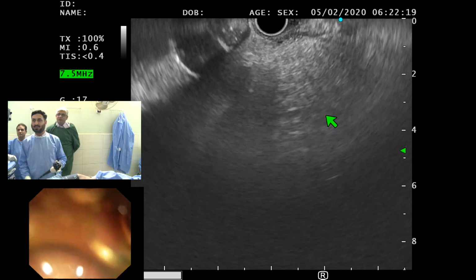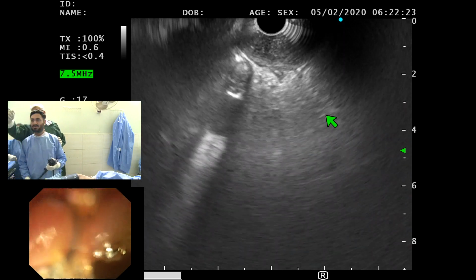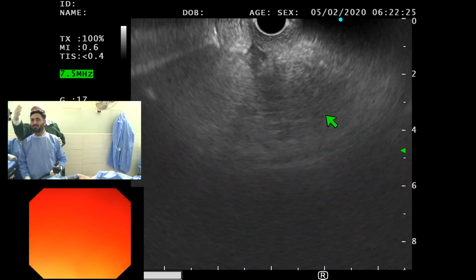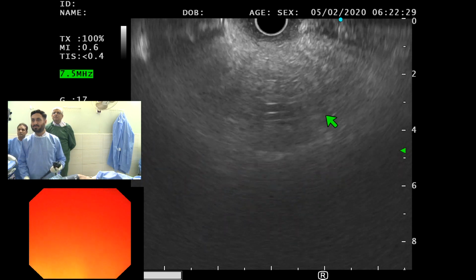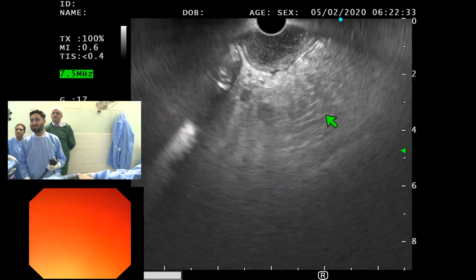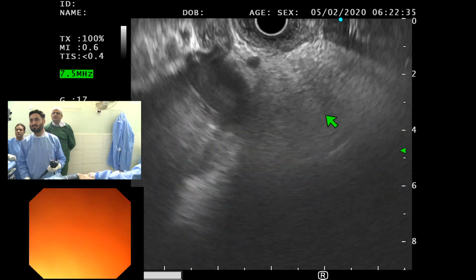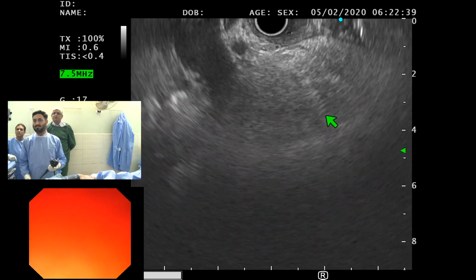When you pull back, your subject will come from the left, where it's out towards you. You advance the other way, it will go. In this situation, but you've lost the thing now. I'm not sure whether you're still in the duodenum or have you fallen? I know, but are you?